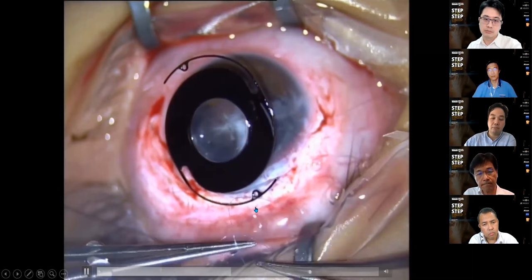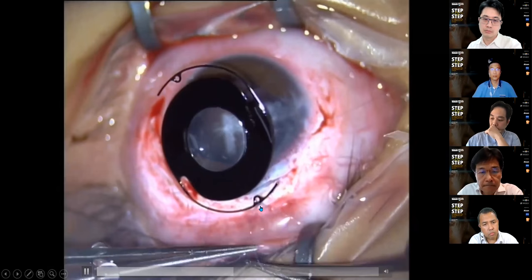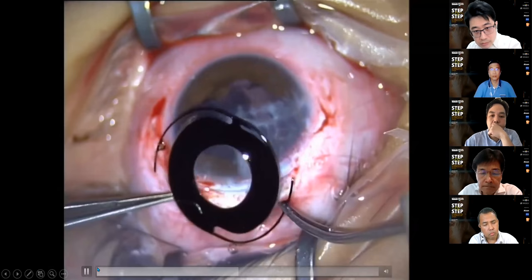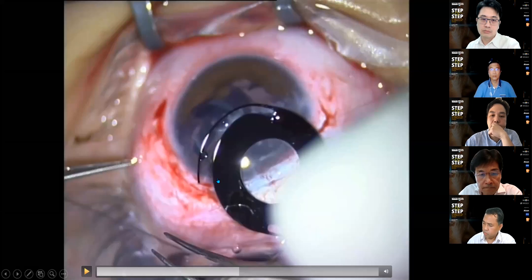One thing I want to note is that when you suture, I advise you to suture with the knot facing towards the outer surface of the eyelet, not the inner surface. If you tie it to the inner surface, then especially if you use a soft IOL, which I'm going to show you later, when you firmly try to center the IOL, this part of the eyelet might rotate and can cause tilting of the lens.